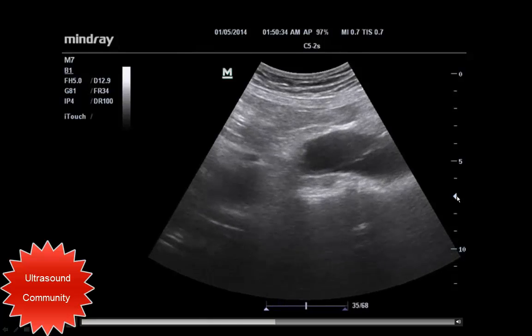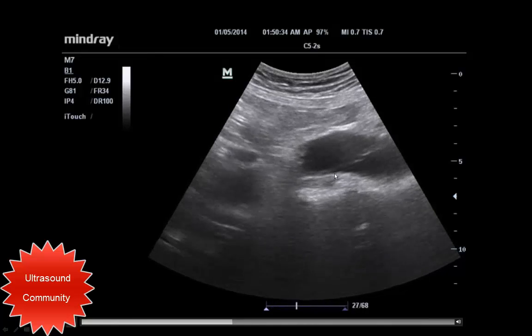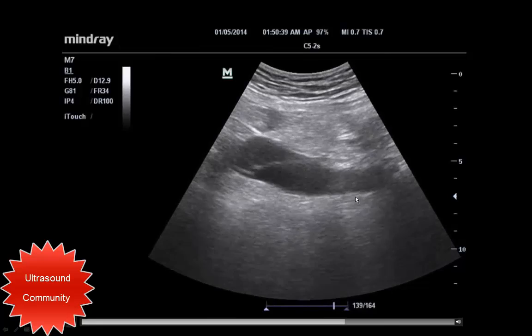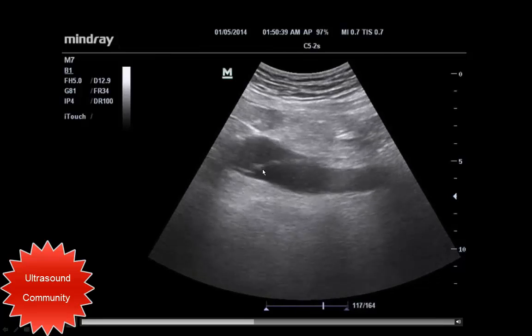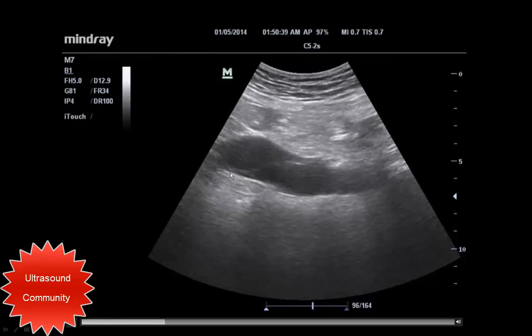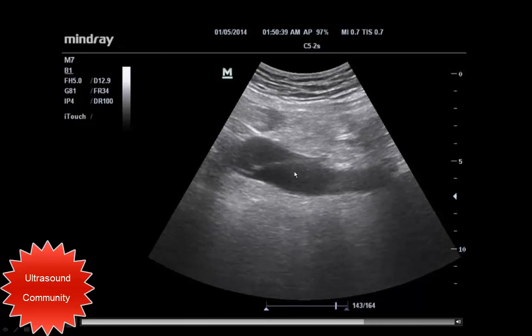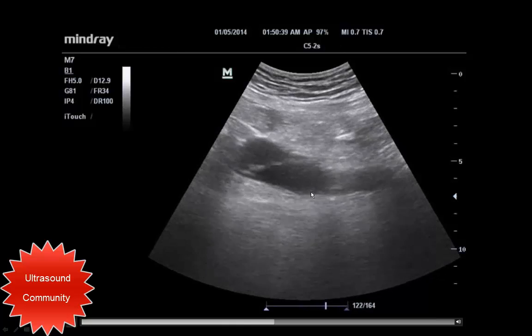The patient's abdominal aorta shows a hyperechoic line also in the longitudinal axis, but a bit unusual here that we could not see the whole longitudinal axis of the aorta in one view. This is another view. Again you see there is a hyperechoic line in the middle of the aorta, and this really represents the dissection and intimal flap of the dissection.